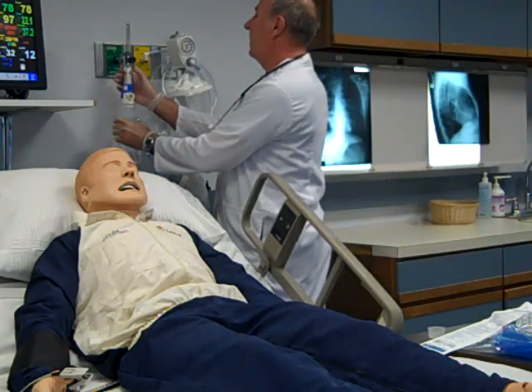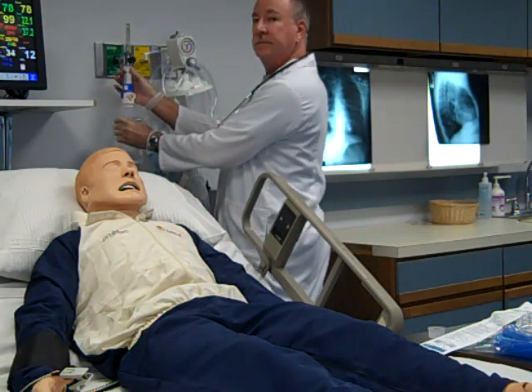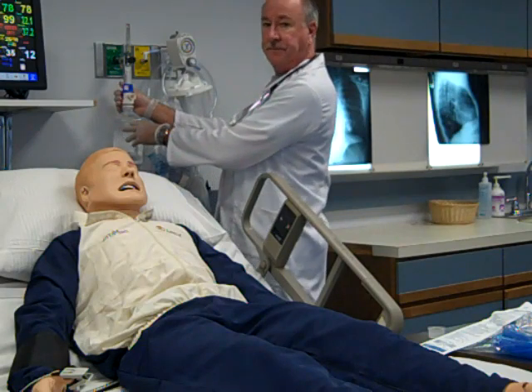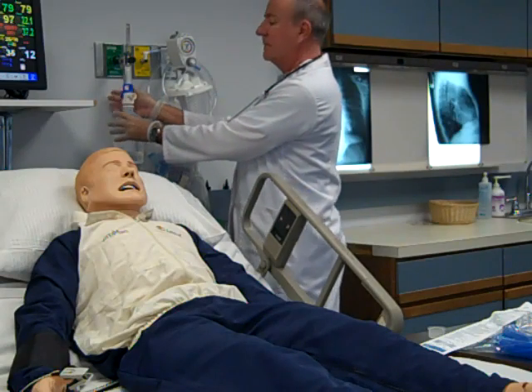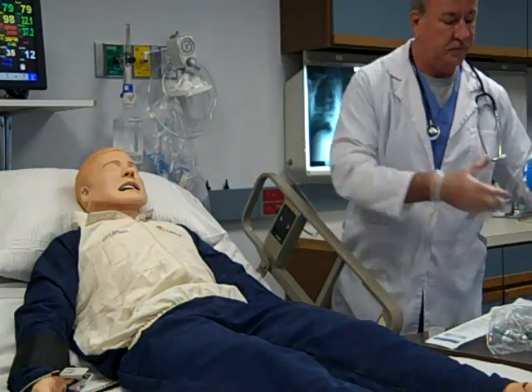Screw the flow meter onto the oxygen outlet at the patient bedside. Screw the assembled large volume nebulizer onto the flow meter using the adapter on the neb head. Attach the large bore aerosol tubing onto the outlet of the neb head.